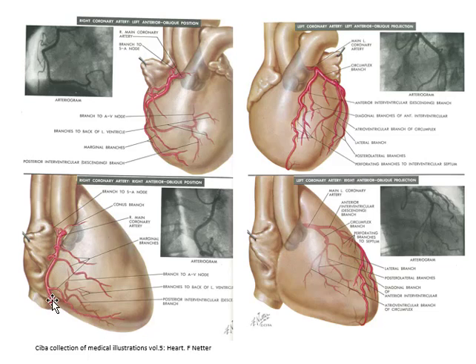And you can see how this does almost a right angle bend and vessels go inwards, so that this region of the heart has overlapping vessels. Whereas the left system in the LAO, the LAD stands out here just off the vertical and the circumflex goes off to the right.